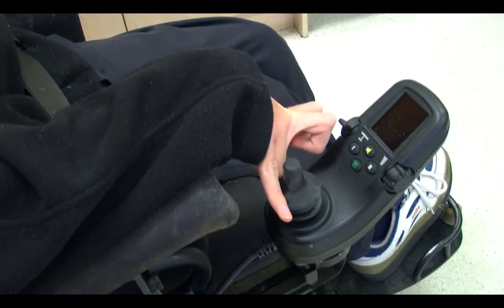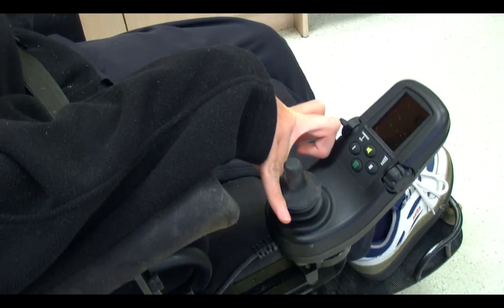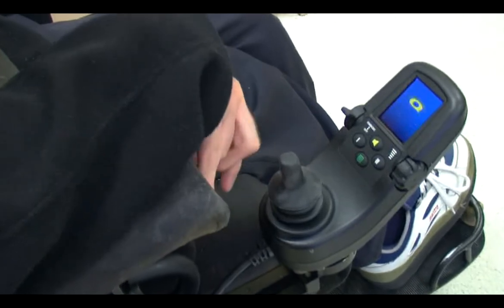To turn the chair on, you just push this knob up and it should come on.